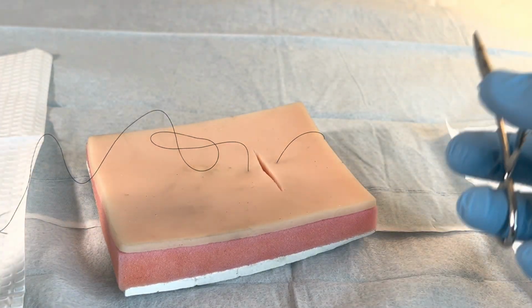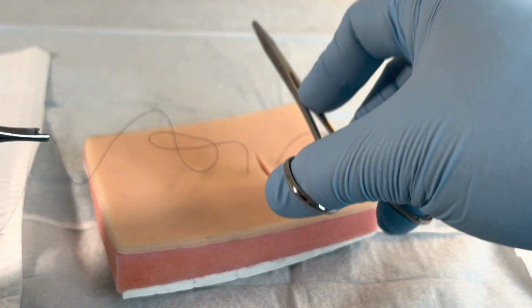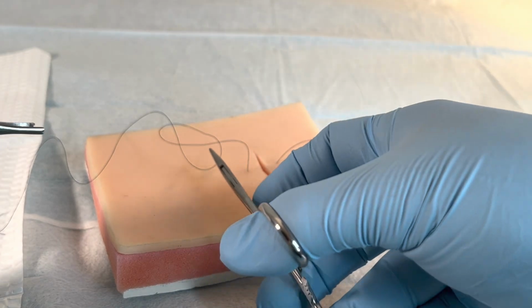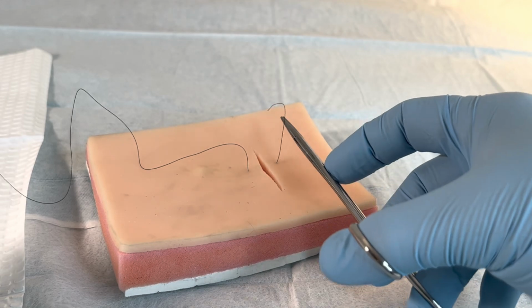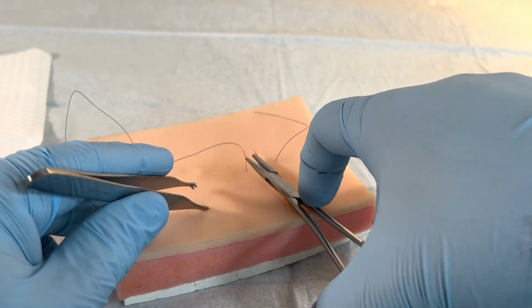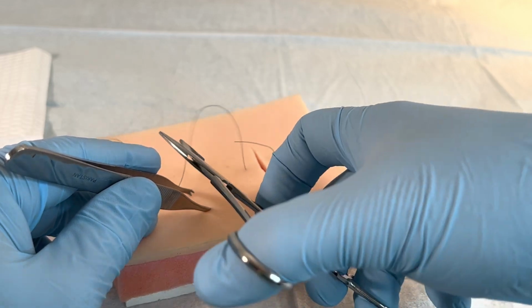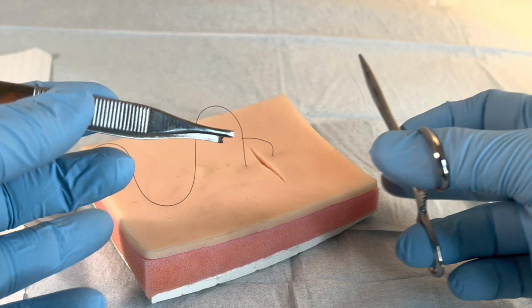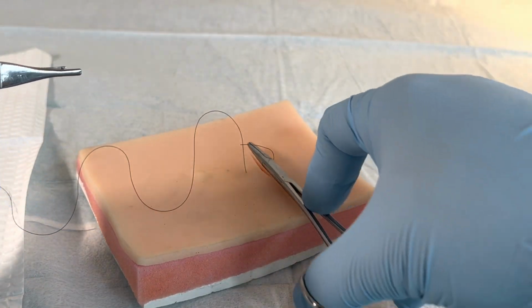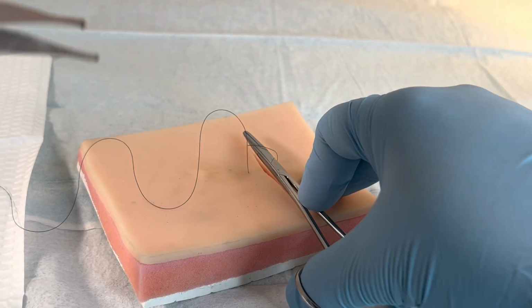So I will always start with taking my needle driver and laying them between the two aspects of the suture, the tail, which would be the unattached end. I'm going to go ahead and pull that through just a little bit more. And the lead end, which has the needle still attached to it. So always instrument parallel to the wound, over the wound, between the two aspects of the suture.